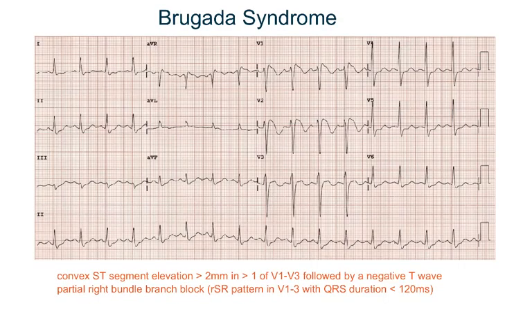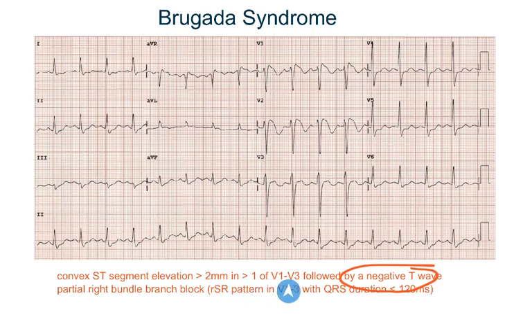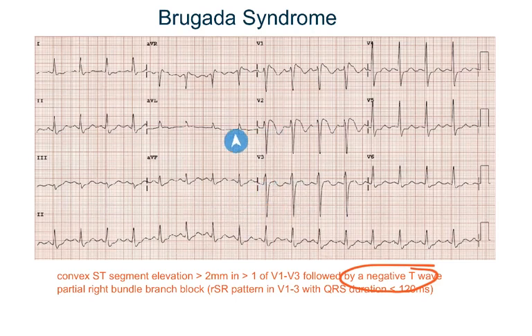In Brugada syndrome, you will also find T wave inversion in leads V1, V2, and V3. But you will also find convex ST segment elevation of more than 2 millimeters in more than one of V1 to V3. In this ECG, the ST elevation is in V1 and V2, not in V3. Also, you will find partial right bundle branch block, meaning an RSR pattern in V1, V2, and V3, but the QRS is not broad as in complete right bundle branch block.